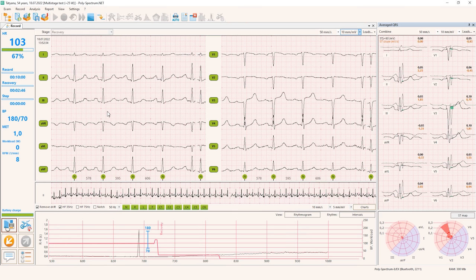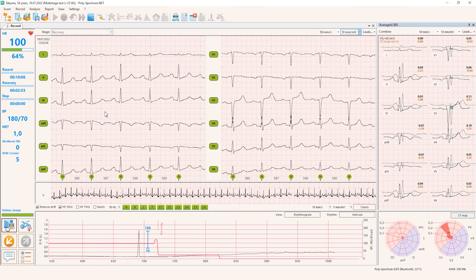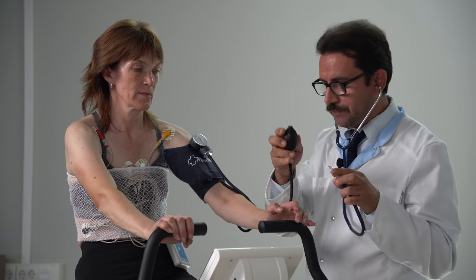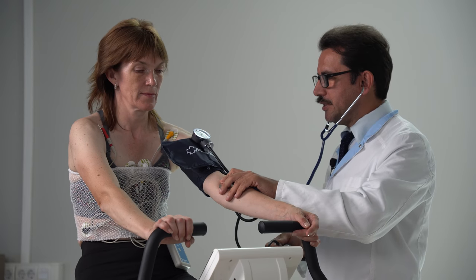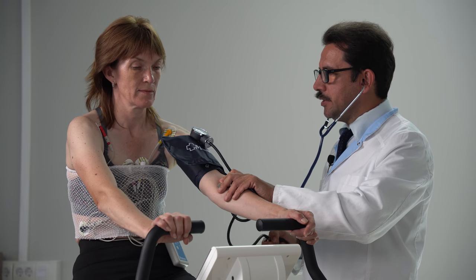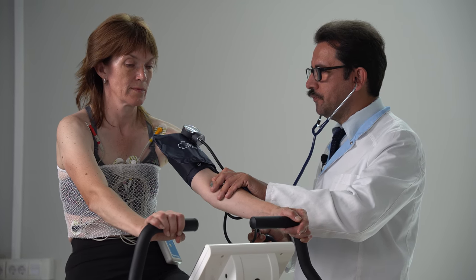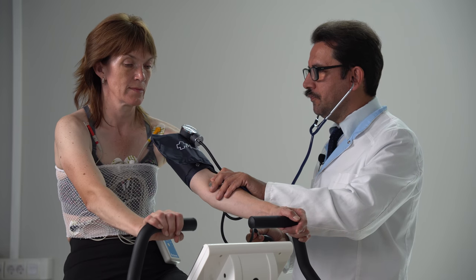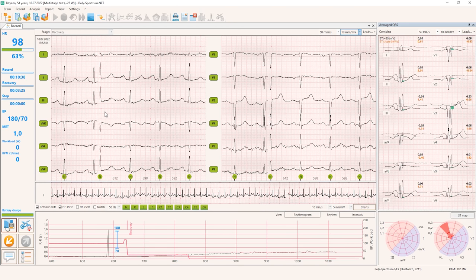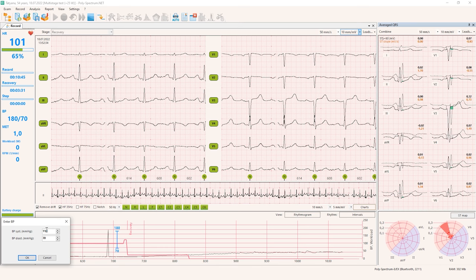Okay, now we are in a recovery period. And recovery can last for a couple of minutes. So while speaking with you, I forgot about measuring blood pressure on the first minute. Yeah, that's a problem when you perform this test, not in a real situation, but in some lecture condition. But now I can measure the recovery. Very nice. So our blood pressure has recovered completely. It's really the same as in the beginning of the test.